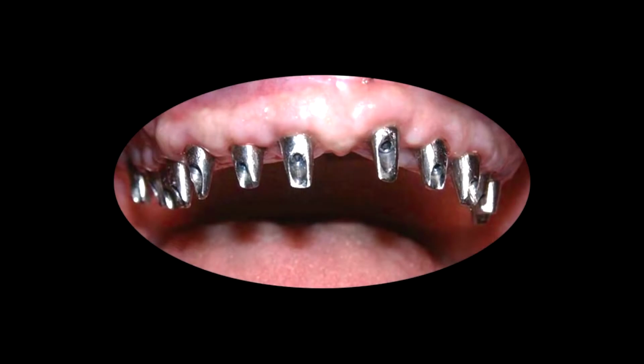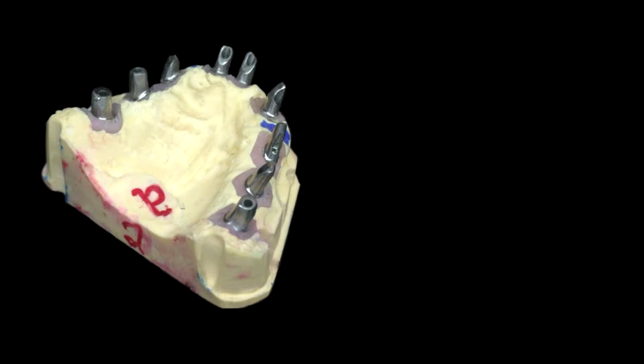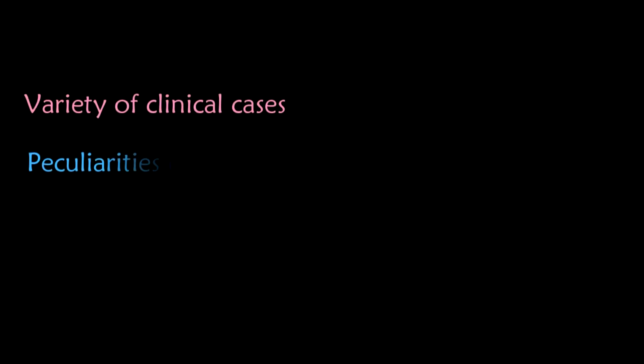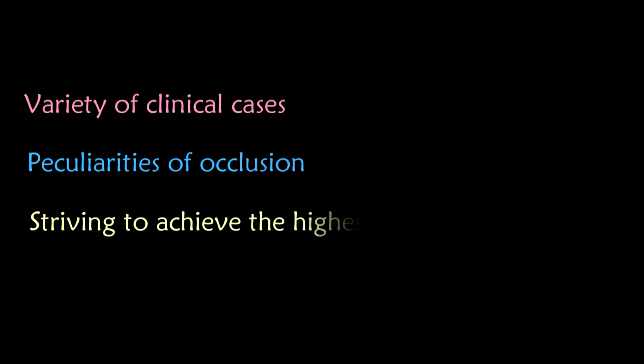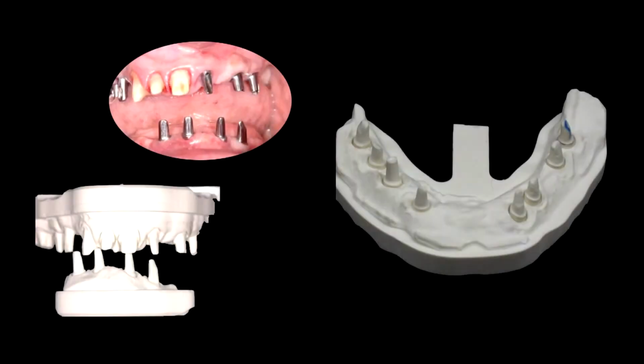Yet, in case of multiple or total implantation for restoration with cemented structures, it is almost impossible to avoid individual preparation of each abutment due to complexity and specificity of many clinical scenarios. Of course, CAD/CAM technologies increase an opportunity of production of identical abutments specific for each patient. However, these technologies don't provide an ideal solution of all issues.